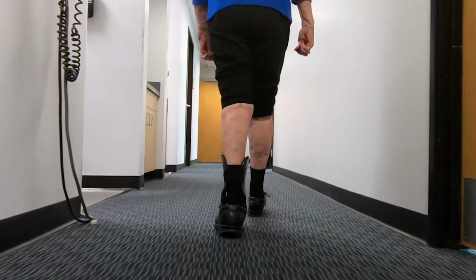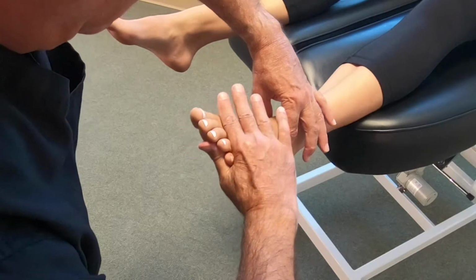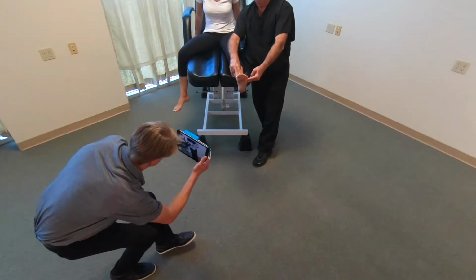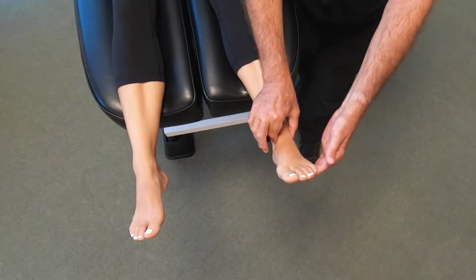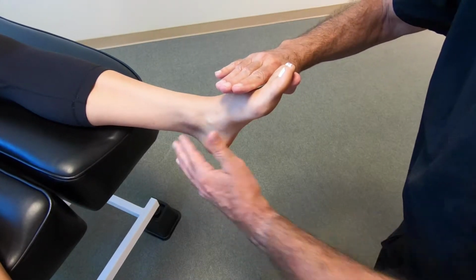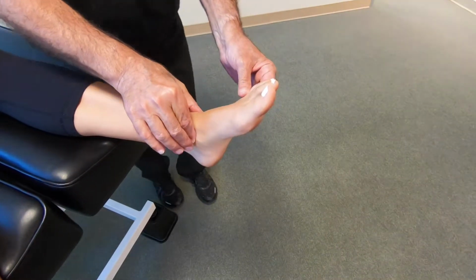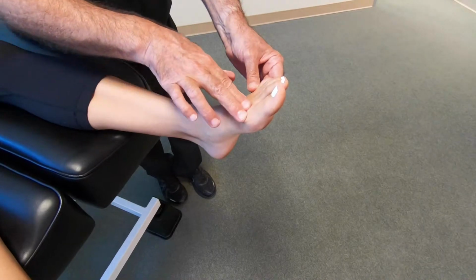I'm going to show you different techniques for proper patient positioning for the Richie Brace. Most practitioners cast the foot in a supine position. This can still be accomplished with a digital cast, but it requires a slight modification. The challenge is capturing the posterior anatomy of the heel and lower leg. We position the foot in subtalar neutral, locking the mid-tarsal joint, and plantar flexing the first ray to eliminate forefoot supinatus deformity. The practitioner must step around the foot from the usual position in order to allow an assistant with the scanner to obtain a proper digital image.